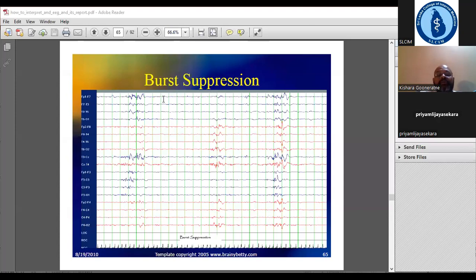So we see burst suppression or suppression burst activity, especially when we treat patients with status epilepticus. One therapeutic where we have the epileptiform discharges, we will suppress the activity for about 12 seconds, and then you see the burst of around say 5 seconds.